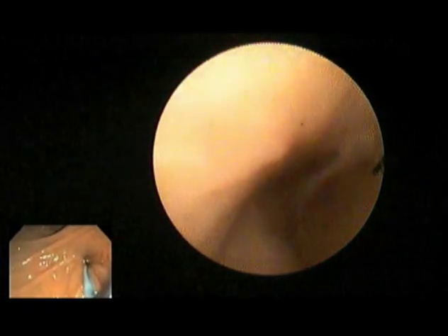Again, here you see the SPY forceps clearly entering. Just like any other biopsy, it's important to make sure the assistant or the technician taking the sample also acknowledges to you that you have an adequate piece of tissue. And important to also remember that these are very small samples. One of the important issues with tissue acquisition in this area is going to be how the pathologist interprets it.